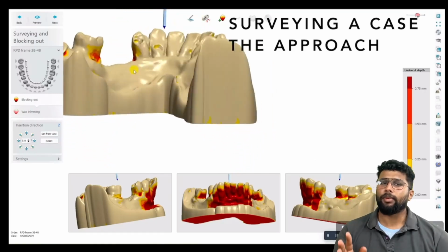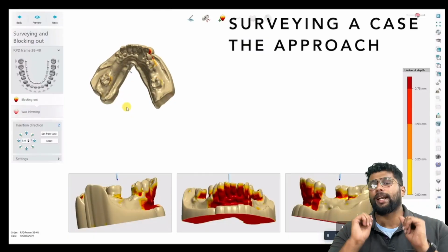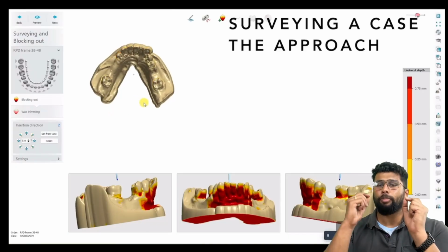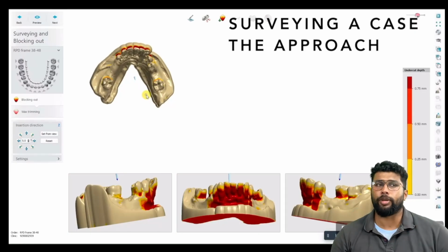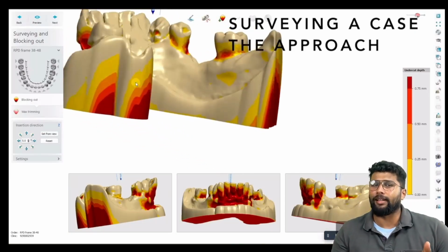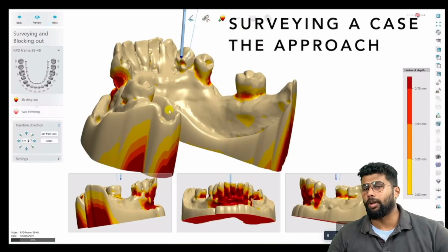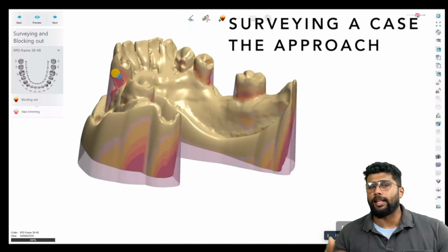But my aim is to make sure that the CPD sits and is removed in as vertical a fashion as possible. I don't want the patient to be tilting their head or tilting the CPD too much in order to seat it. Practically speaking, more than 10 degrees of tilt of the patient's mouth or the prosthesis is not possible clinically, and that is why we choose as straight a path of insertion as possible. And if the tooth contours are unfavorable, we would prefer to slightly reshape them.